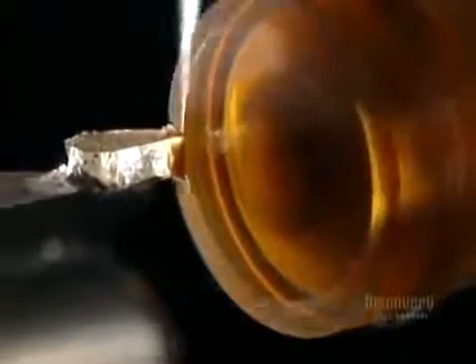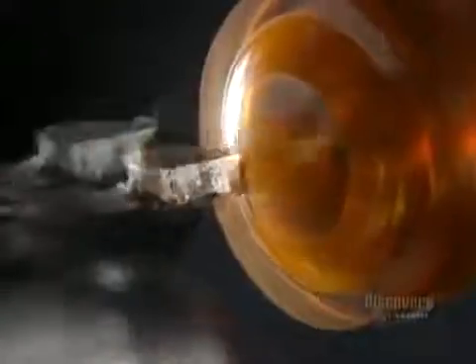The comfort of a lens is also determined by its thickness. It must be as thin as possible while retaining sufficient solidity. They begin by shaping the outer diameter of the lens, which takes only a few seconds.